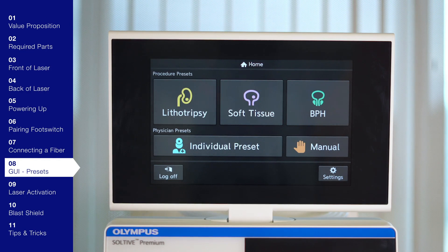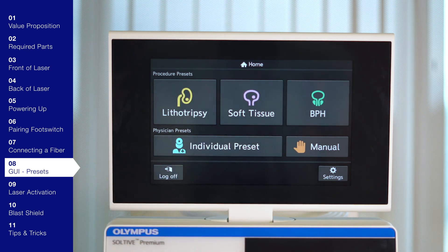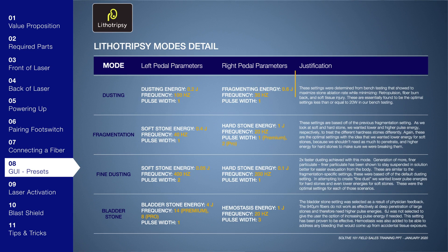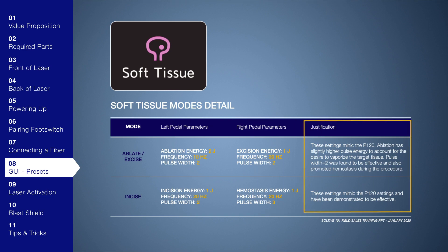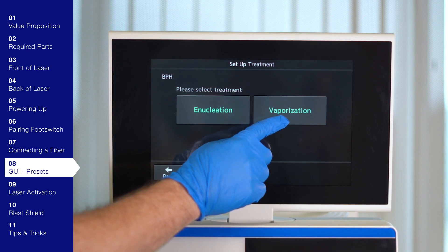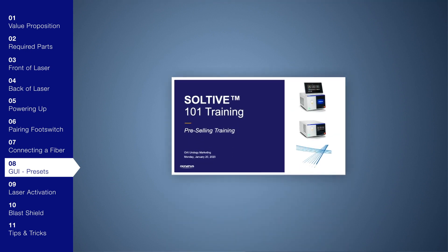Now the Soltive laser is powered on, the foot switch and fiber are connected, and we're ready to choose the procedure and adjust laser parameters. We recommend using the presets available within lithotripsy, soft tissue, and BPH procedures. Within lithotripsy you have dusting, fragmentation, fine dusting, and bladder stone modes. From the lithotripsy mode's detail, you can see the recommended parameters and justification for the left and right pedals. Within soft tissue, you have ablation and incision modes. Within BPH, we have enucleation and vaporization modes, each with recommended presets for the left and right foot pedal. All these charts can be found in the Soltive 101 Field Sales Training PowerPoint.